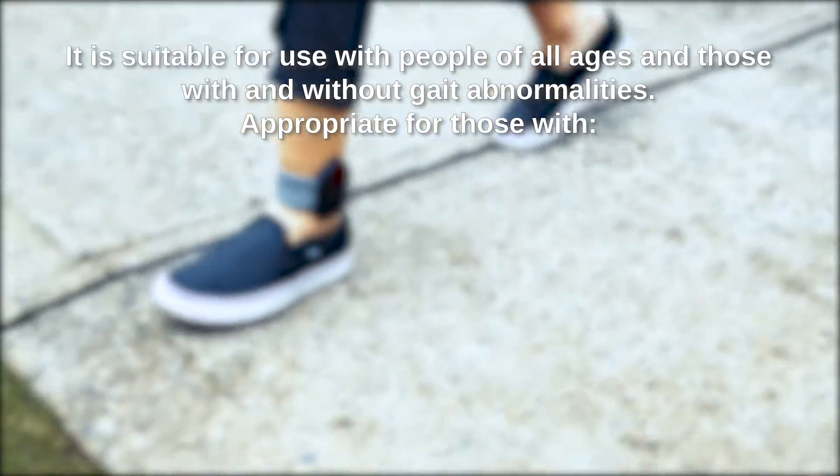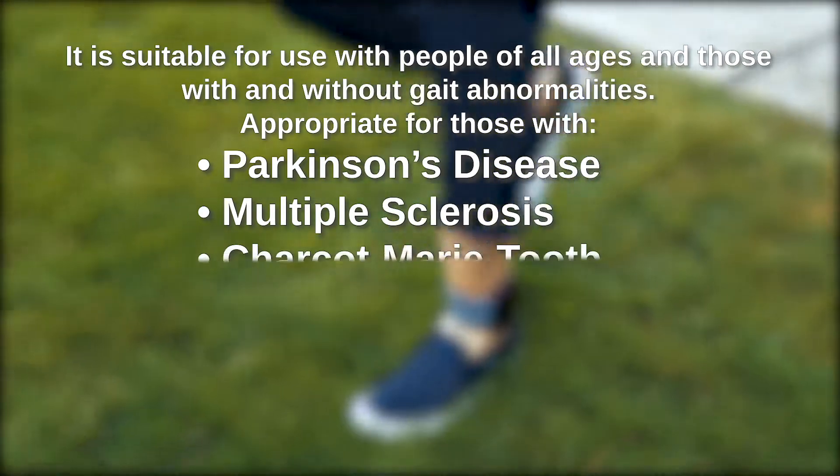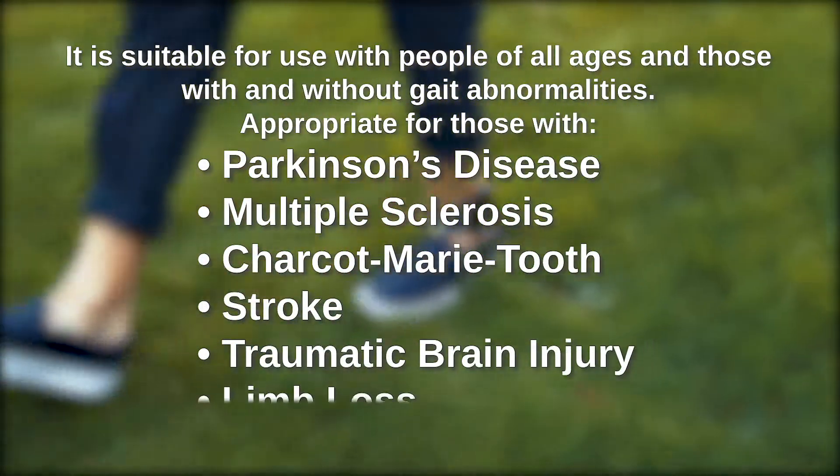It has been found valid and reliable for those with Parkinson's disease, multiple sclerosis, Charcot-Marie-Tooth, stroke, traumatic brain injury, and limb loss.